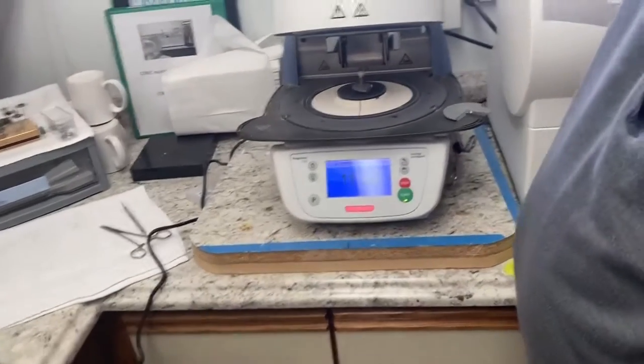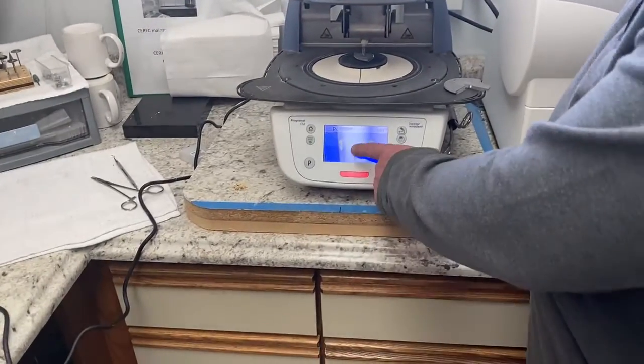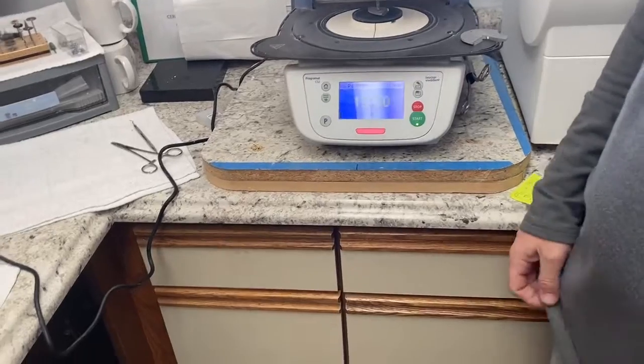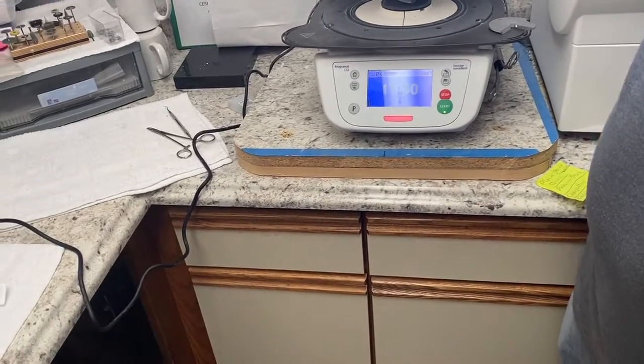Yeah, so then it's just going to take care of itself from here. And it does the countdown. You set a timer and leave it in your pocket for whatever that says.